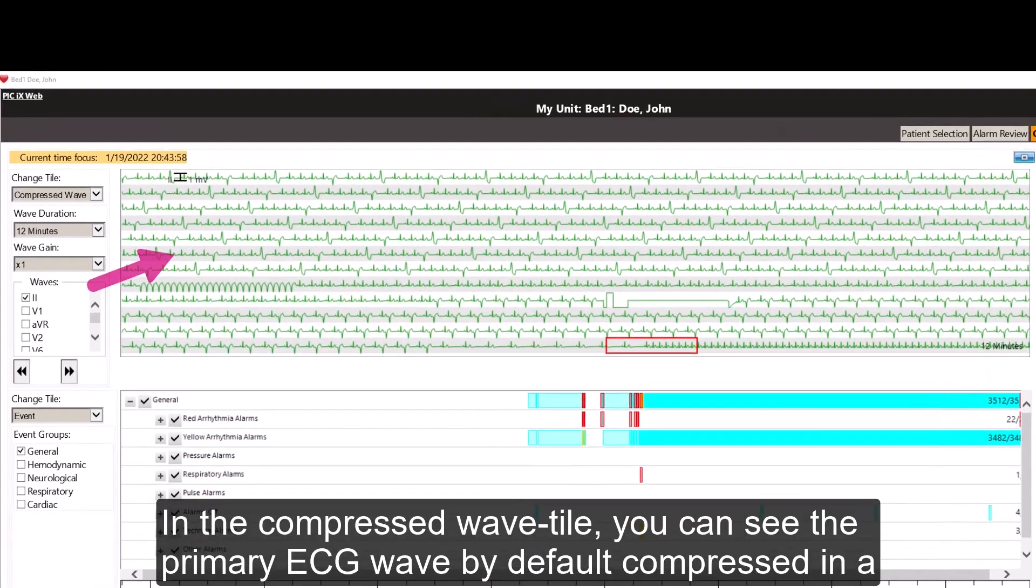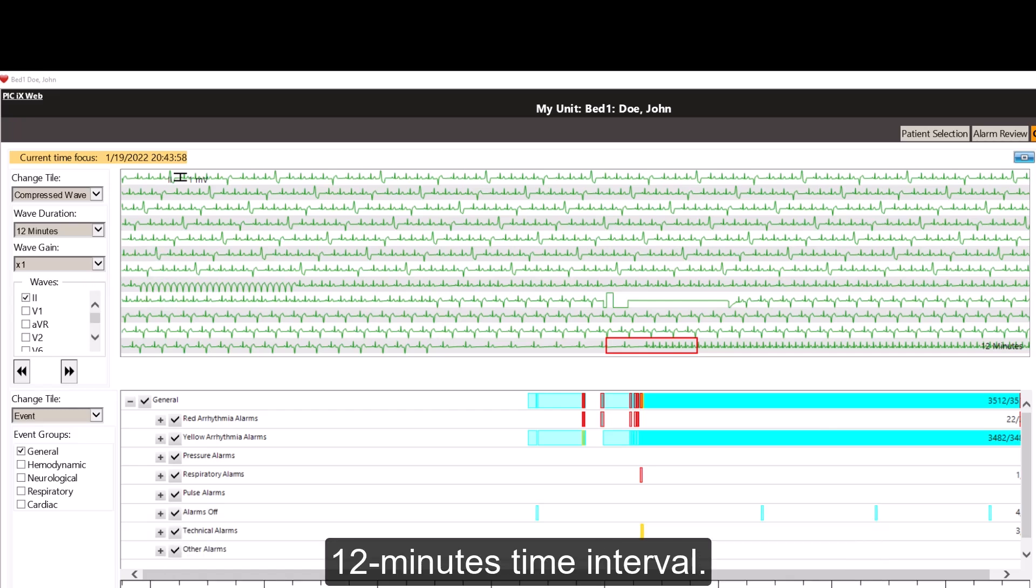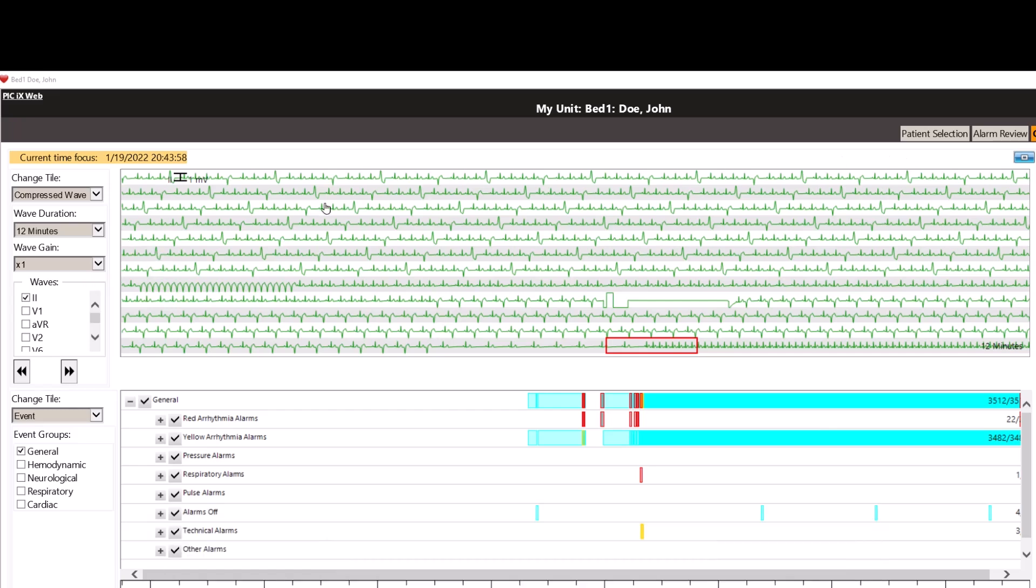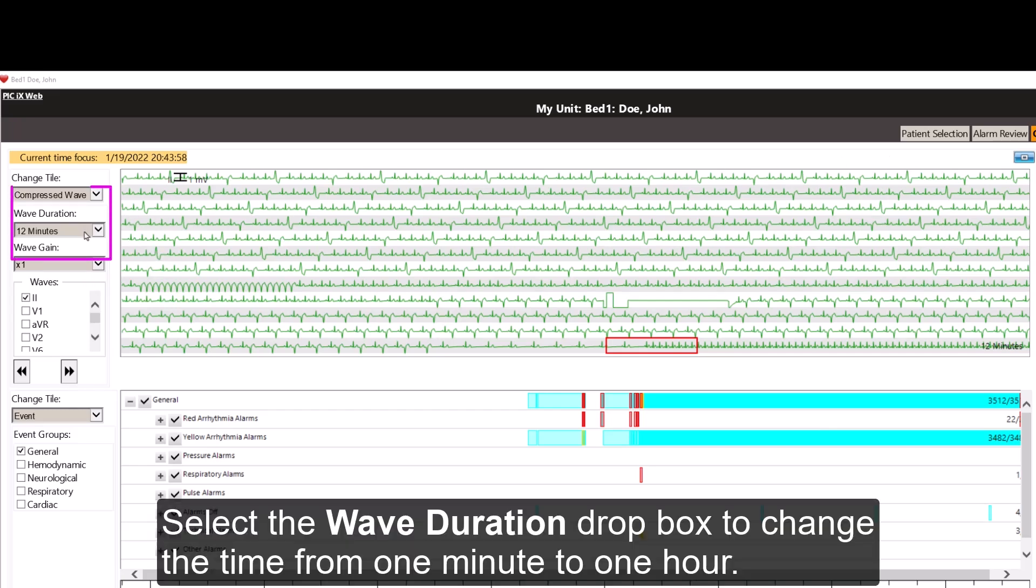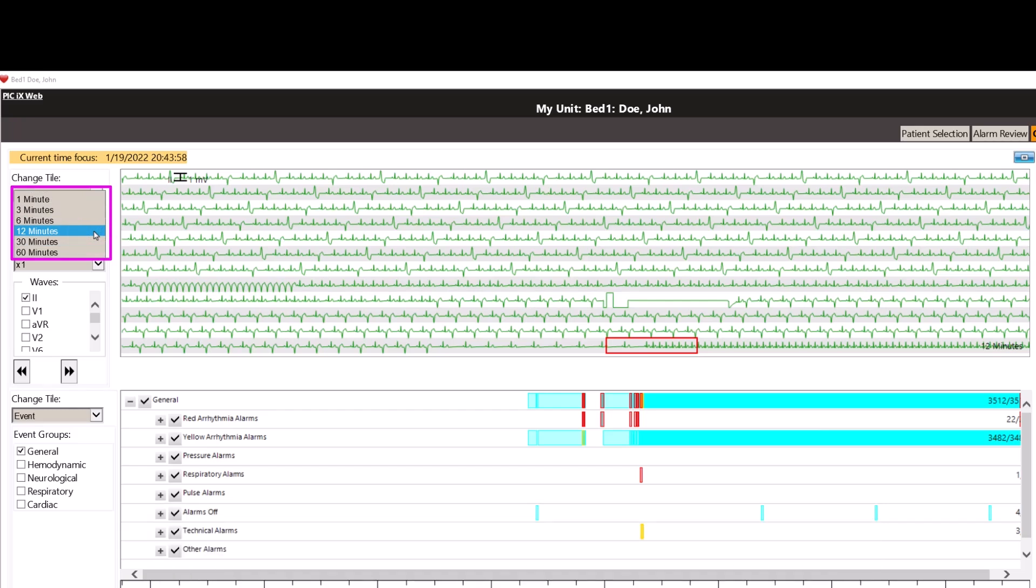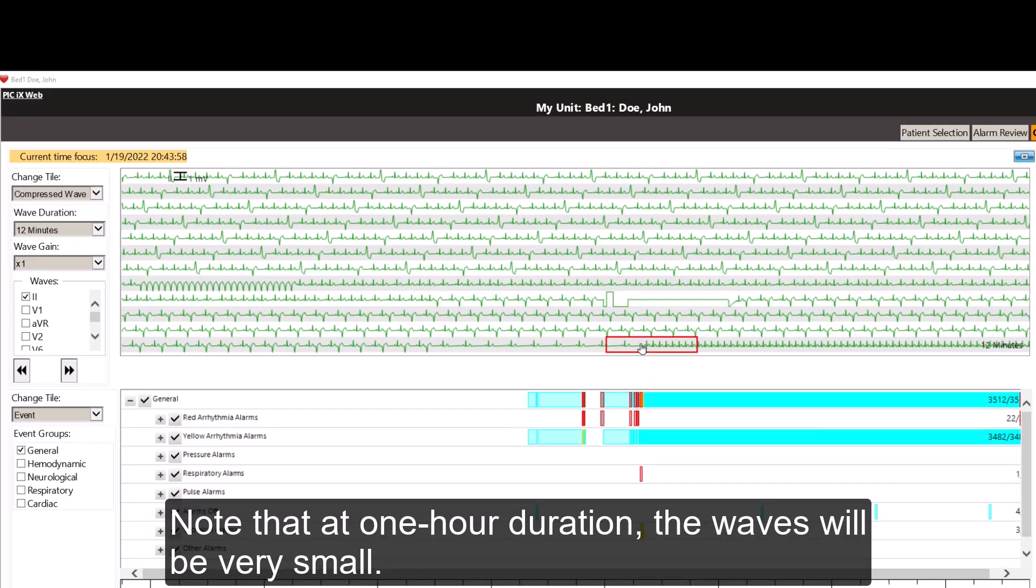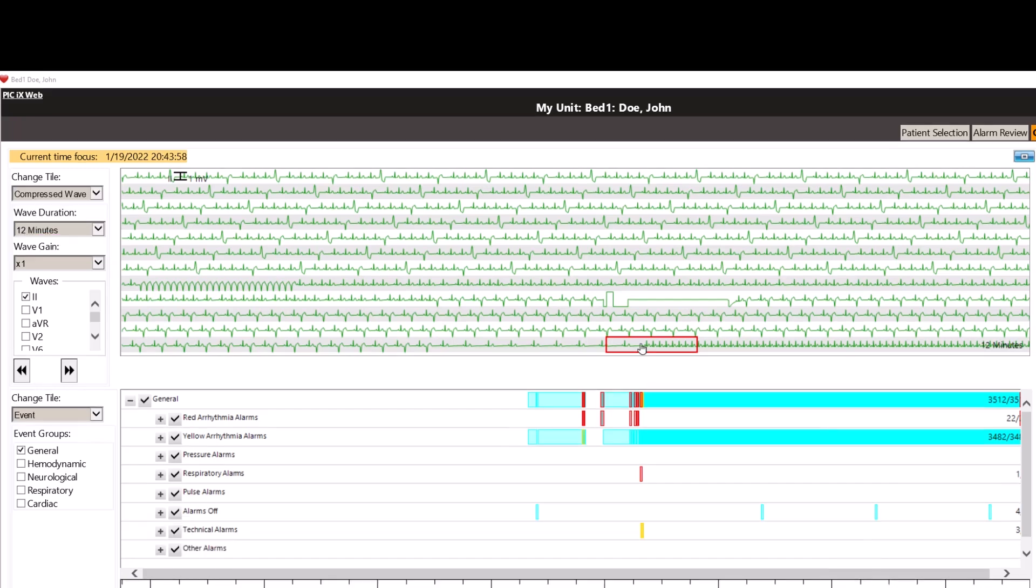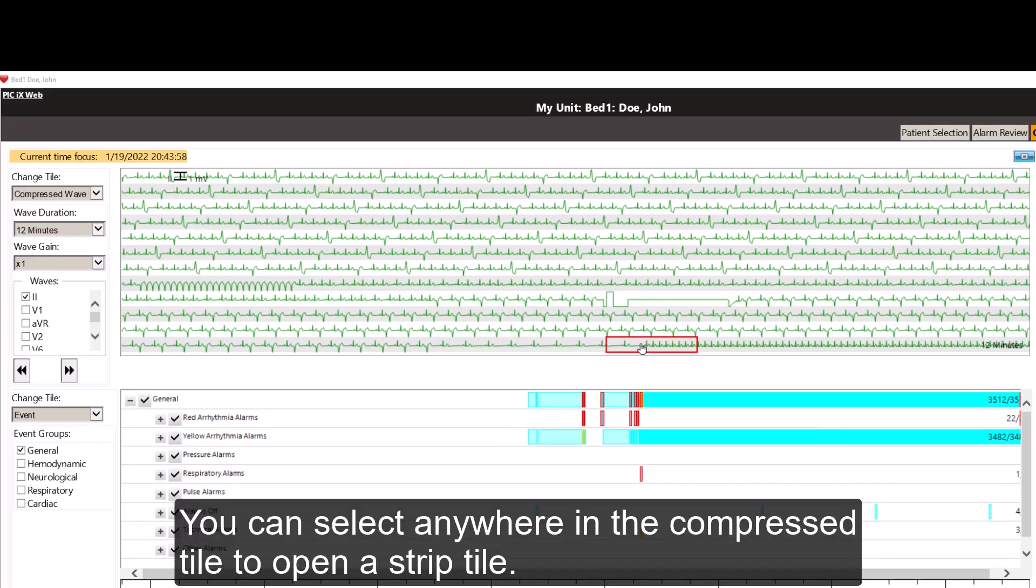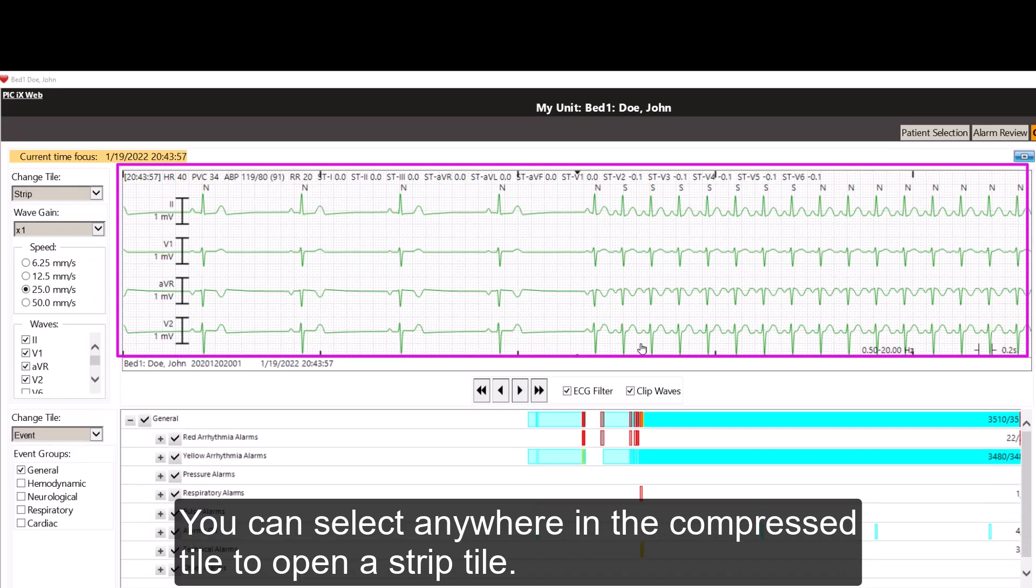In the compressed wave tile, you can see the primary ECG wave by default compressed in a 12 minutes time interval. Select the wave duration drop box to change the time from 1 minute to 1 hour. Note that at 1 hour duration, the waves will be very small. You can select anywhere in the compressed tile to open a strip tile.